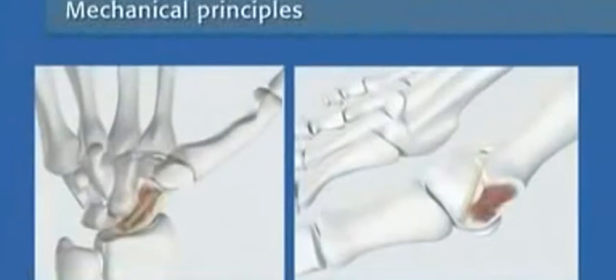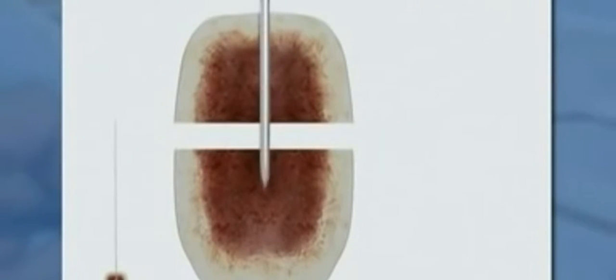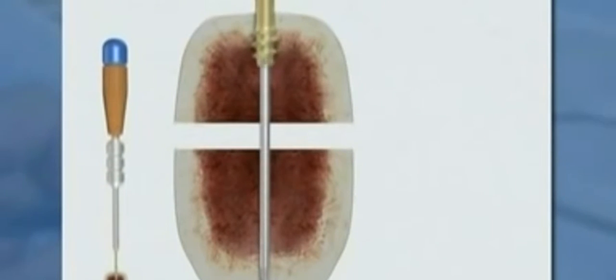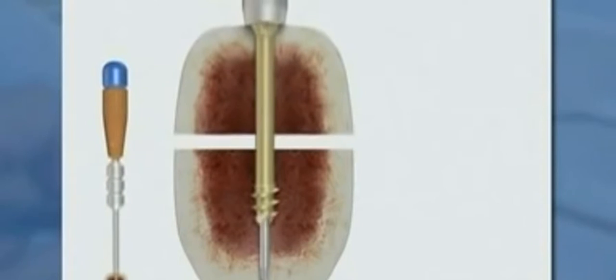These basic steps are followed regardless of the specific indication. The guide wire is inserted into the bone. In hard bone, pre-drilling is done with the cannulated 2 millimeter drill bit. Pre-drilling should stop short of the threaded portion of the guide wire. After measuring the screw length, a screw is attached to the compression sleeve and its handle. This assembly is inserted over the guide wire.